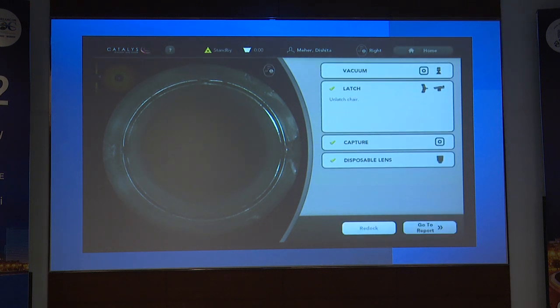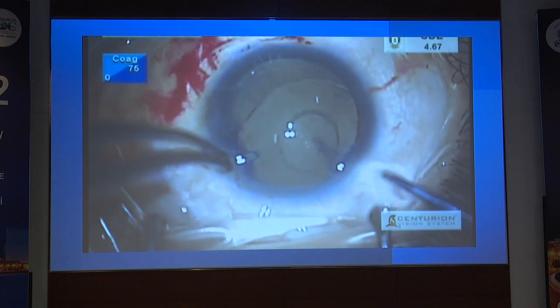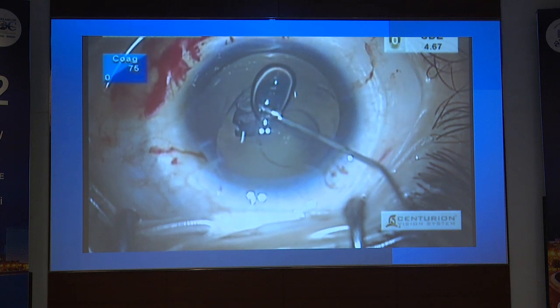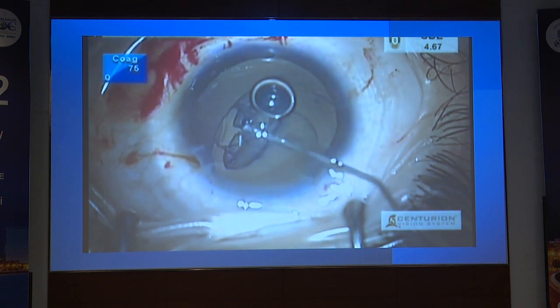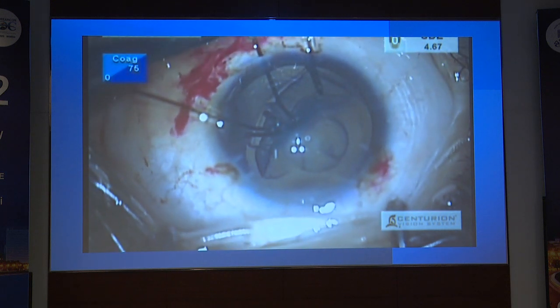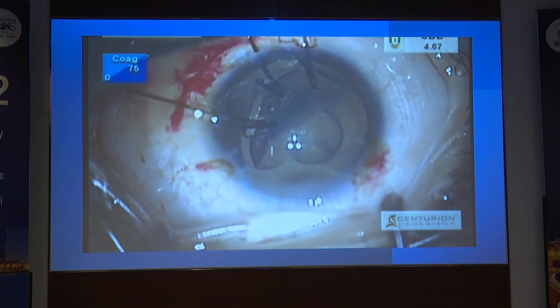This gives us a perfect punched out rhexis. Next, we use sodium hyaluronate to create space for us between the capsular fornix and anterior rim of the bag and the cortex. If you do cases like this, then we can use capsular hooks, which differ from traditional iris hooks in having smooth paddles at their ends to spread the forces applied.